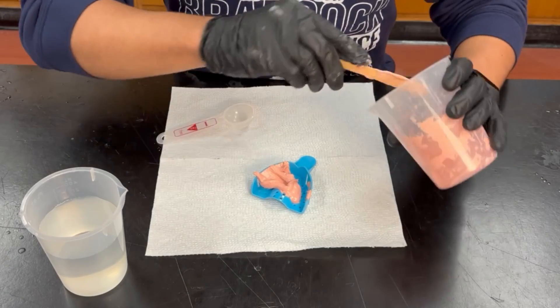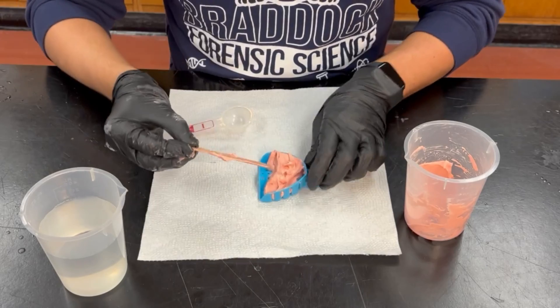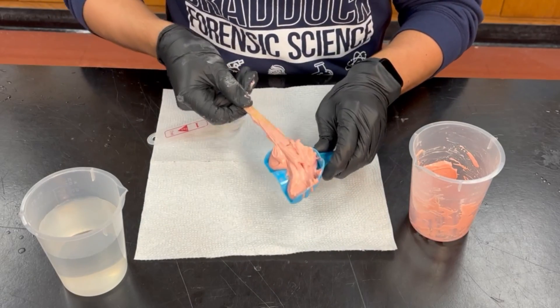Now you will add this mixture to your dental tray and gently spread it evenly — make sure it is not hanging on the back of the tray. Use a clean wooden stick to remove any excess from the tray.